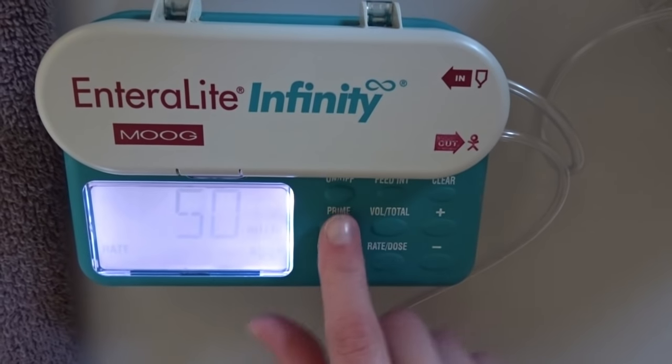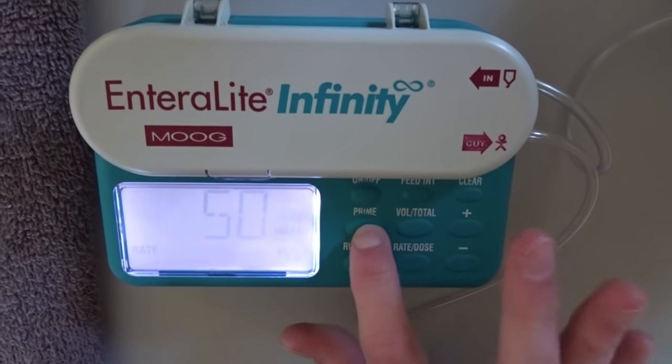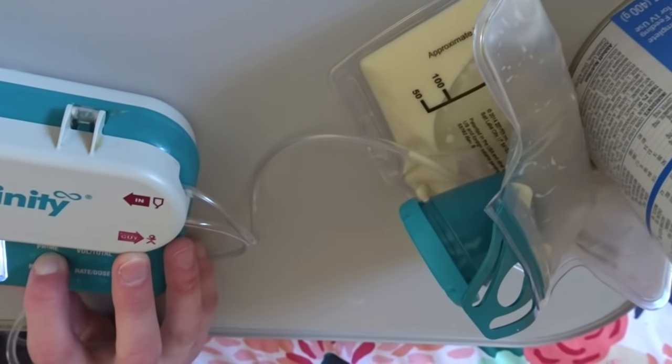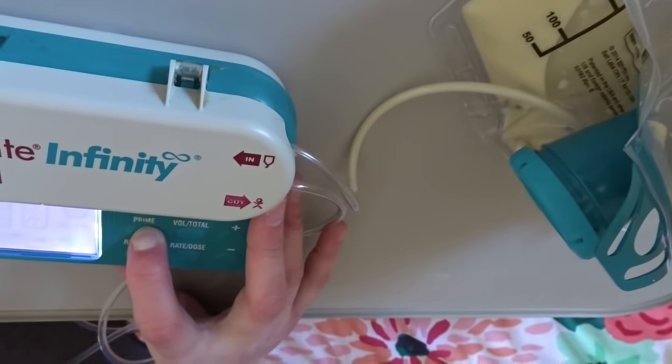My rate is already preset at 50. When you press this button right here, this is prime. It's pretty self-explanatory, this part. You kind of want to loosen this end cap right here while you're priming, or else it will shoot off and fly across the room.